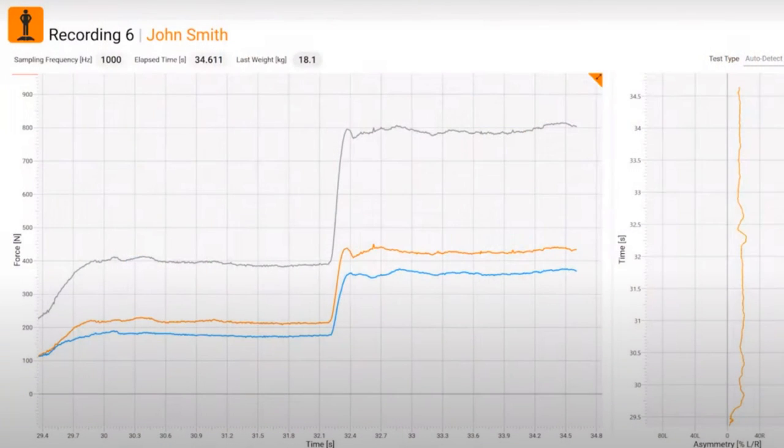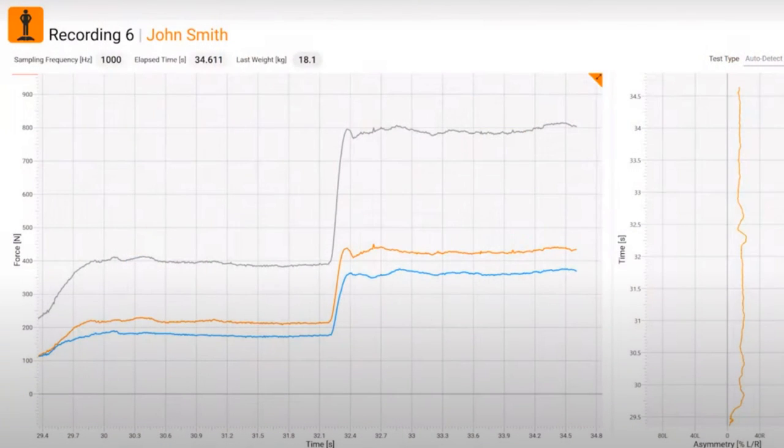Now that you've collected data from your isometric mid-thigh pull using a consistent protocol, what about the analysis? The first thing to do is check the trace — the raw force-time curve — and look for errors in the data. Two key things to look out for: firstly, check for a counter-movement, which shows up as a dip in the force trace at the start of the test. You may even be able to see it with your eye whilst doing the test. If the athlete has even a tiny dip, a tiny counter-movement, then it has not been a true isometric test.